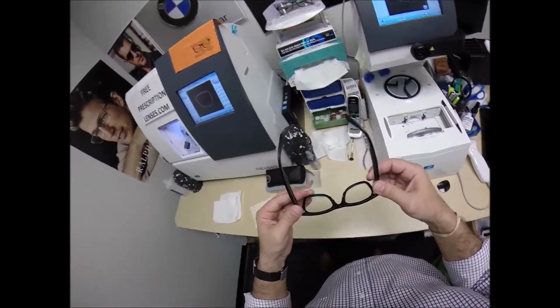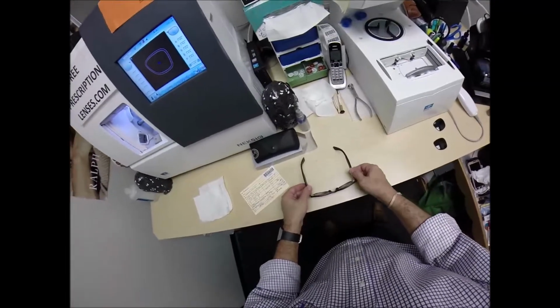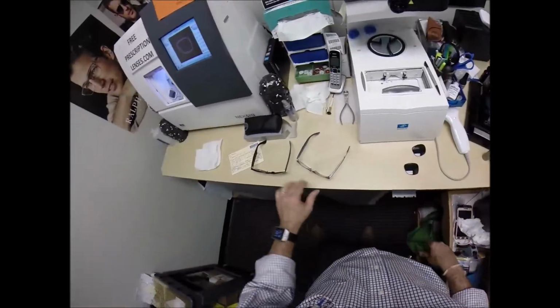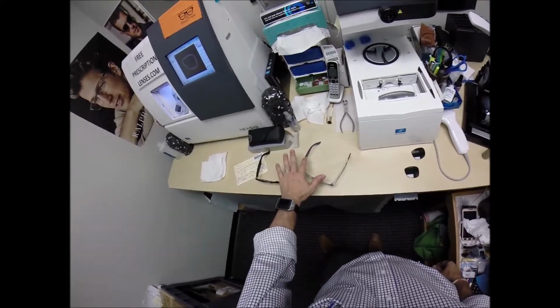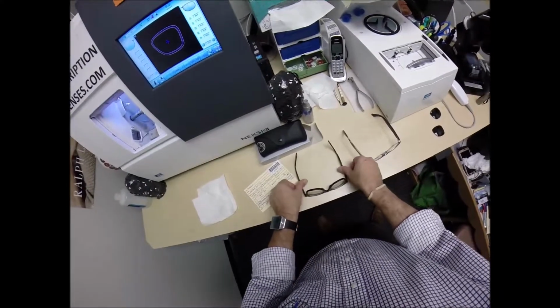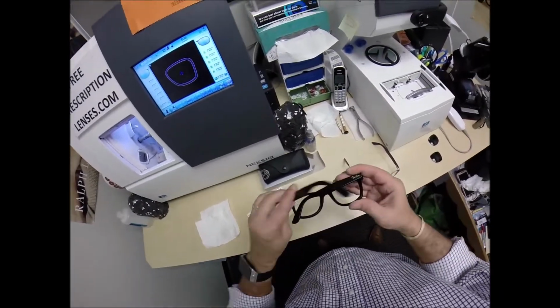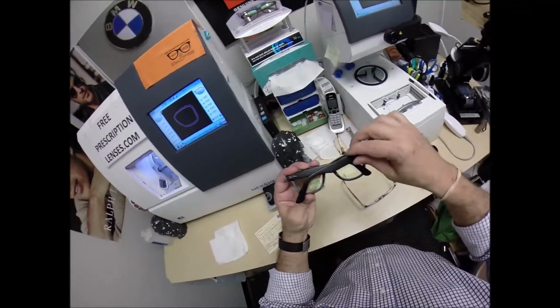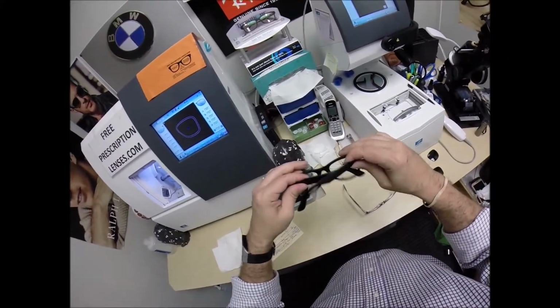But let's go ahead and again get it in standard alignment, so when I press down there is no wobble. When I say wobble, I'm part of that 80%. When I take mine off, they wobble on the counter, but they sit level on me. Now I'm going to flip these over, press down, there is no wobble, close each temple to make sure they overlap perfectly, and they do. I think they do. I can't see them very well. Neither temple is askew like that.